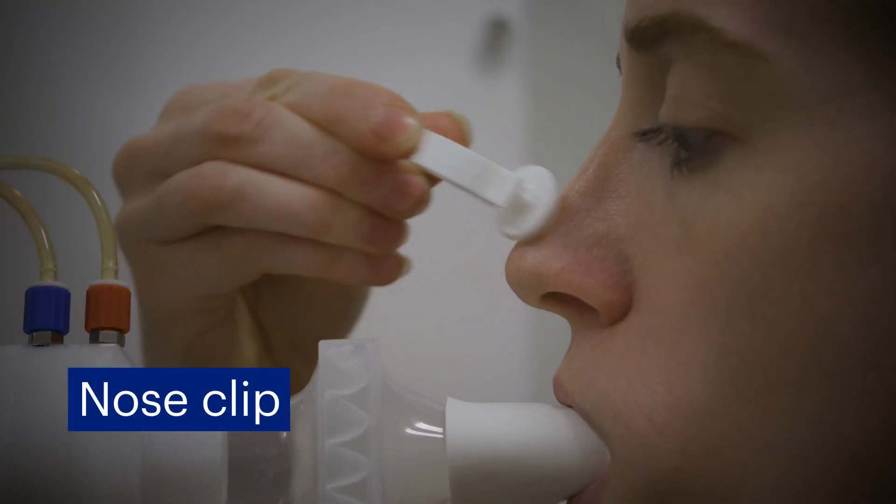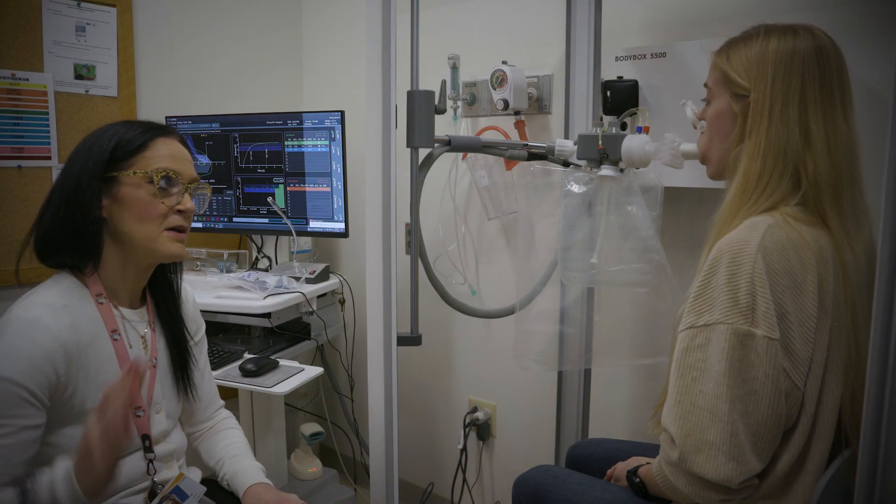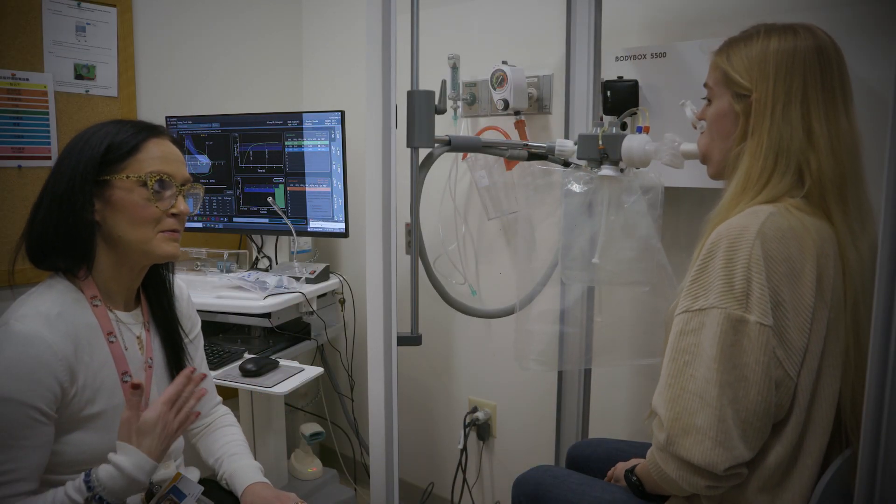The nose clip will prevent the air from leaking out of your nose. The technician will guide you through each step of each of the following tests.